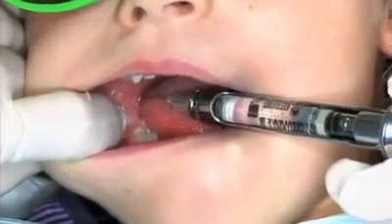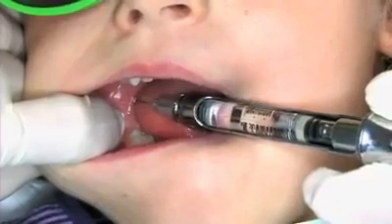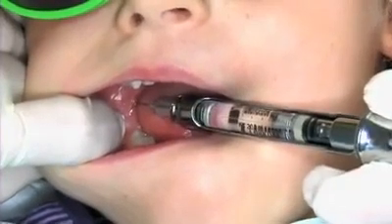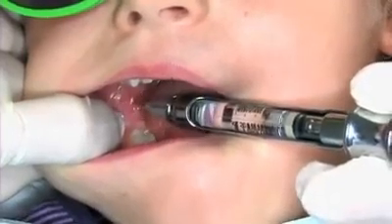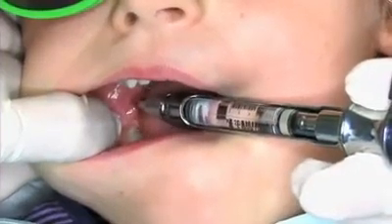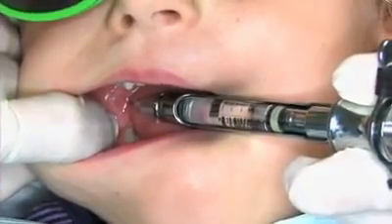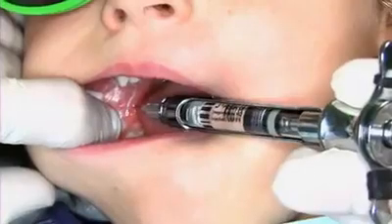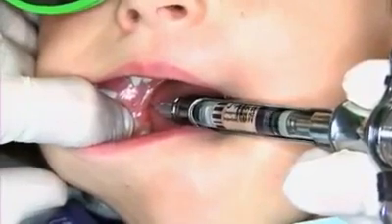After initial contact with the ramus, advance a total of approximately 10 millimeters. The needle should lose contact with the medial surface of the ramus as it slides into the mandibular sulcus. Three-quarters of a milliliter of local anesthetic is deposited slowly over one to two minutes and the needle is withdrawn.